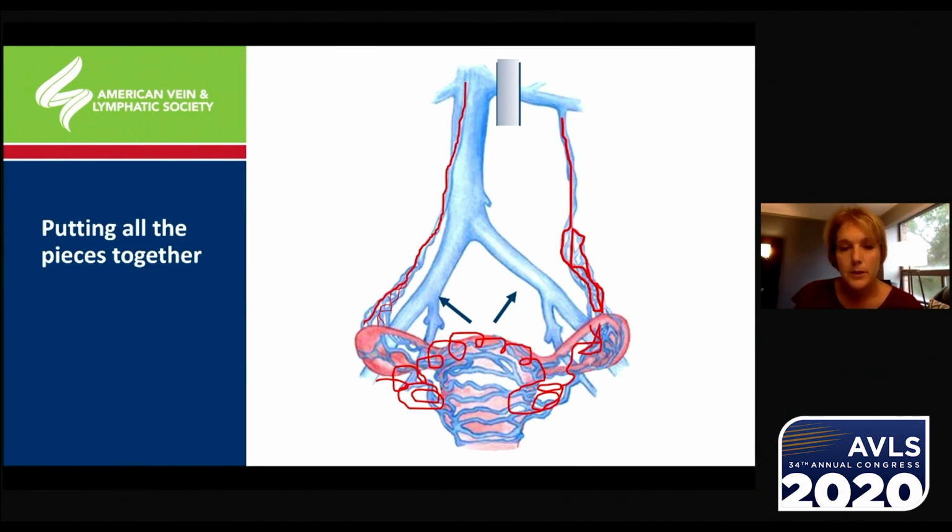And that's really important for two reasons. Number one, the left kidney's outflow is through that left renal vein, obviously, to the IVC. Well, if there's a significant enough compression, the blood from the kidney actually takes the path of least resistance, and it proceeds to go down the left ovarian vein, causing that reflux or retrograde flow.